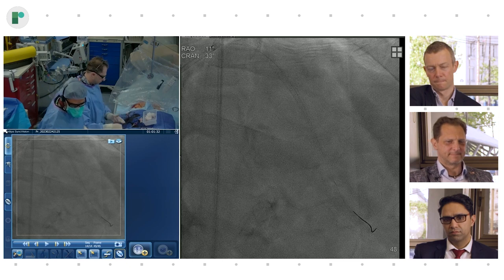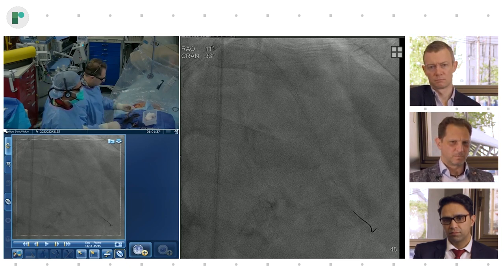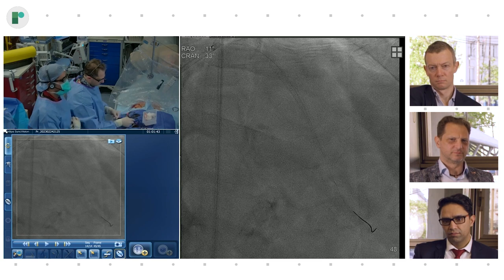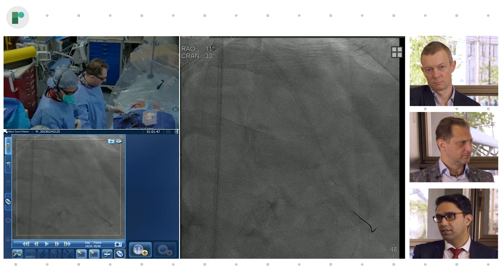So we're going to use a Telemark microcatheter from Surmodics, which is basically a transit catheter. We're going to take it into the stent at the point at which we could see no flow and take an injection through the microcatheter. So that, of course, is a nice technique to be able to minimize dye.